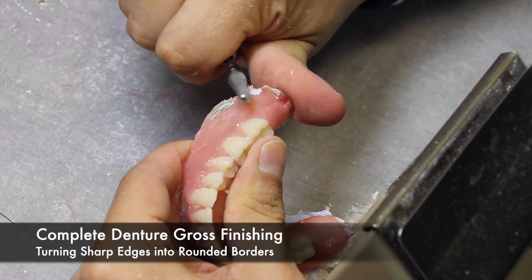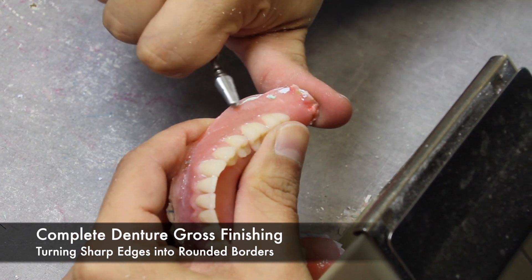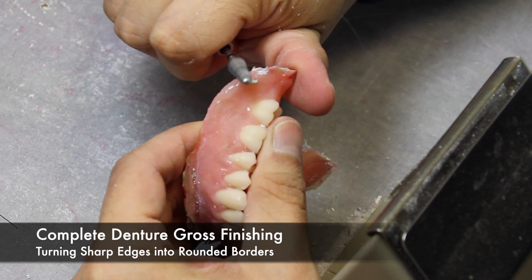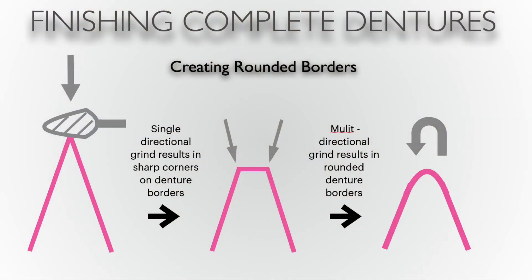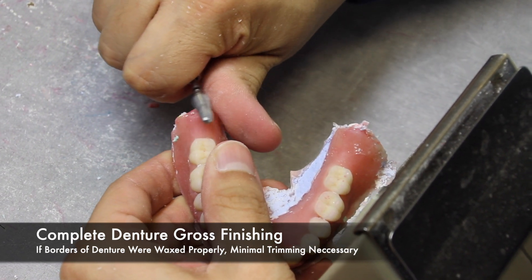As you remove the acrylic flash, you will begin to encounter the denture borders themselves. It is important to turn any sharp edges into rounded borders. This illustration shows the proper use of a carbide burr while rounding borders. When using a carbide burr in only a single vertical direction, as you see in the first image, the result is two sharp edges. In order to create a rounded peripheral roll, we must use the carbide burr multi-directionally, up and over the border to create a rounded denture border. If the denture was waxed properly, it should be easy to determine where that border should end.